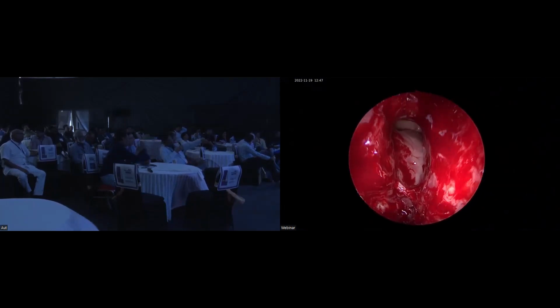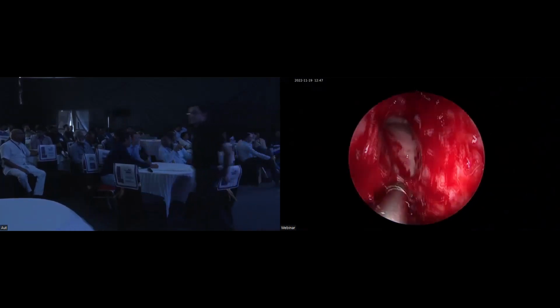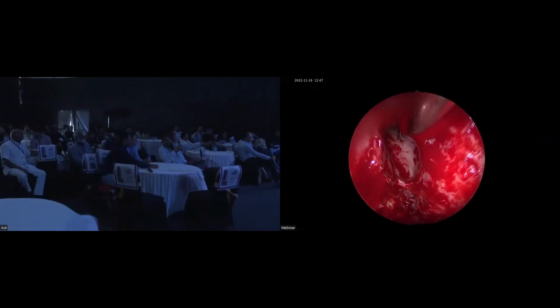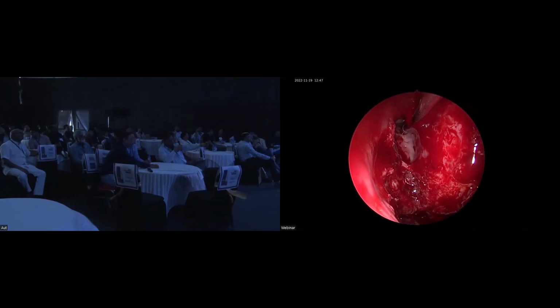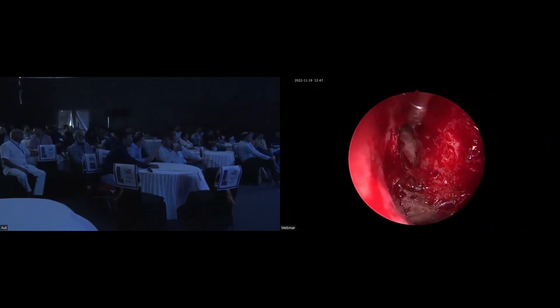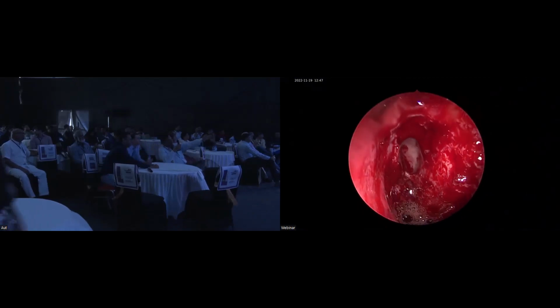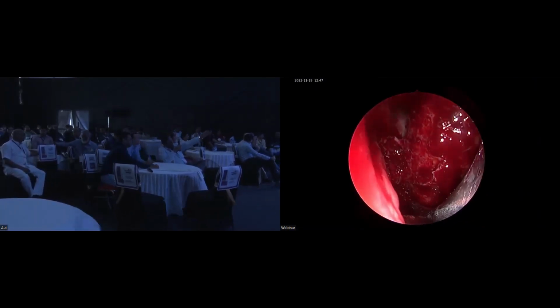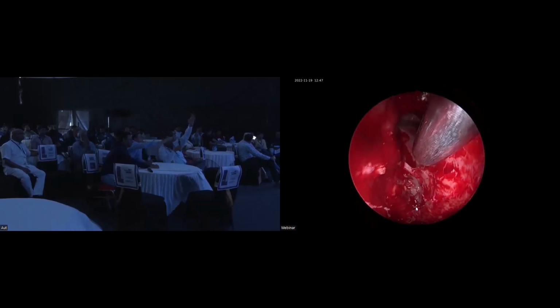This is a cell. 90-degree suction is there? On the posterior border of the frontal sinus, there is always one cell behind. The 90-degree suction. Give me double curve suction. Flush.